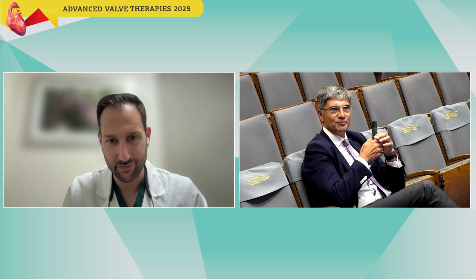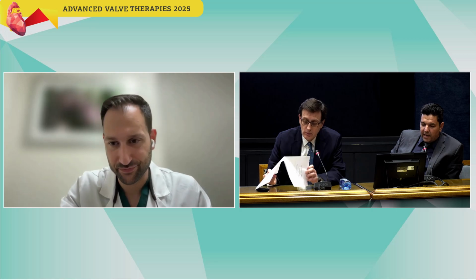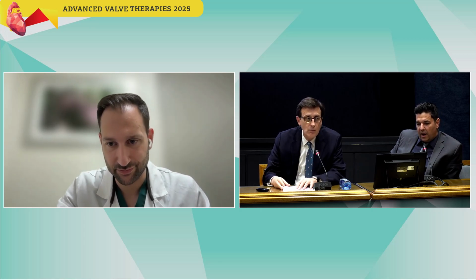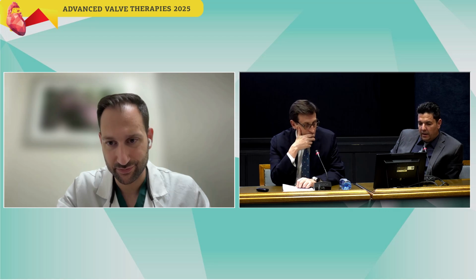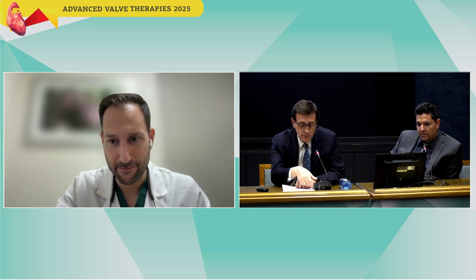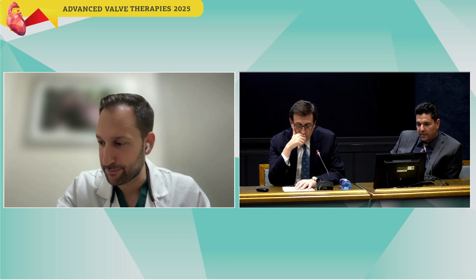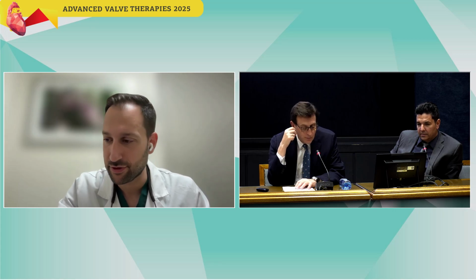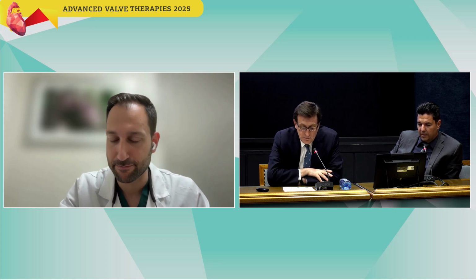Thank you. And I really like the bicuspid case you did, Nico, because I saw there was not much calcium there. I would be very scared to put a valve in with such a small amount of calcium, but it seems your valve stayed in pretty good position, right? Yeah, it was more of a fibrotic pathology, but the valve was very stable and very good.